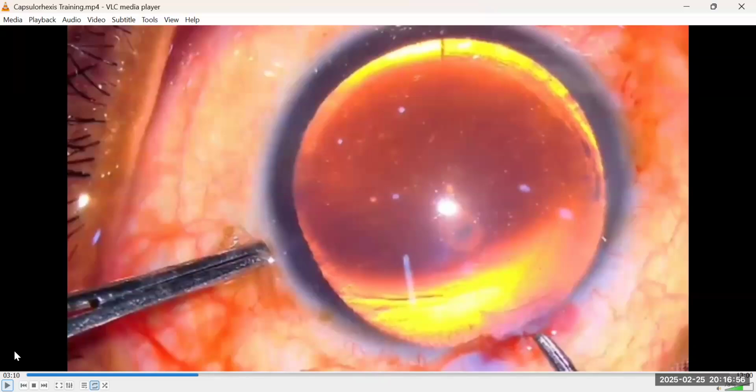If your best instrument is a cystotome, one is advised to cut the knuckle very small, less than 1 millimeter. 1 millimeter is easy to mark out, but the system you want to be using, take your time, take it under the microscope, set a caliper, and bend it yourself. The reason is simple.